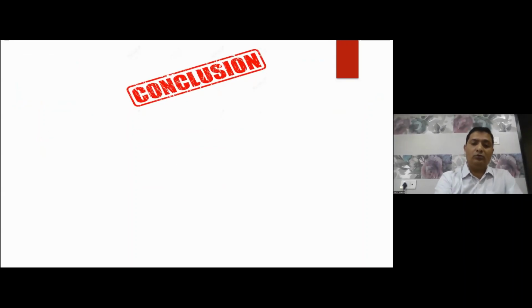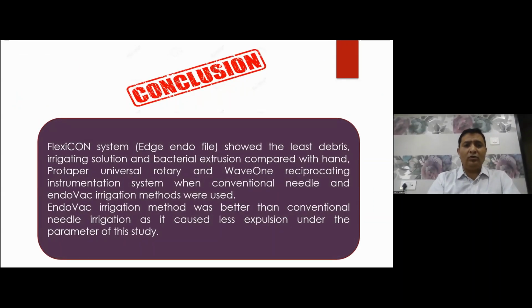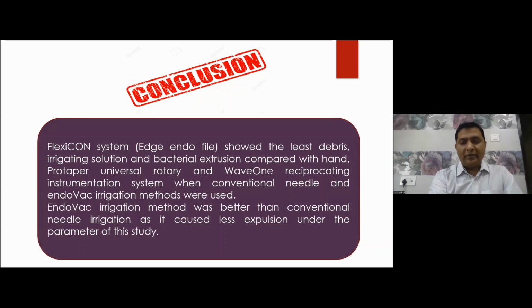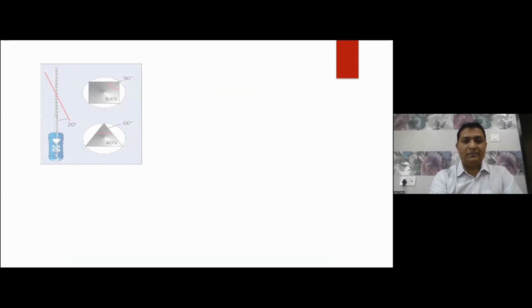Coming to the conclusion, the Flexicon NiTi edge endo file shows the least debris, irrigating solution and microorganism extrusion compared to hand, ProTaper and Wave 1 instrumentation. EndoVac irrigation shows less debris expulsion than conventional needle irrigation. So the operator should choose their instrumentation wisely during the procedure.